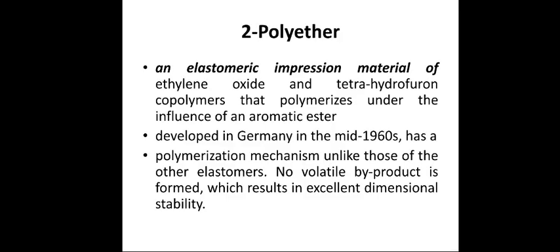The polyether impression material is more precise.